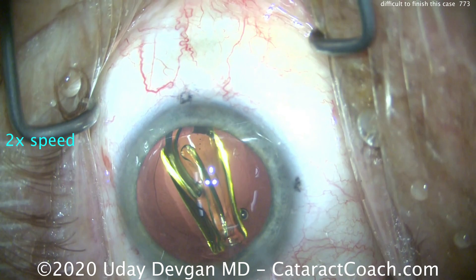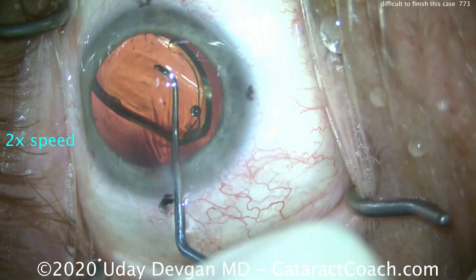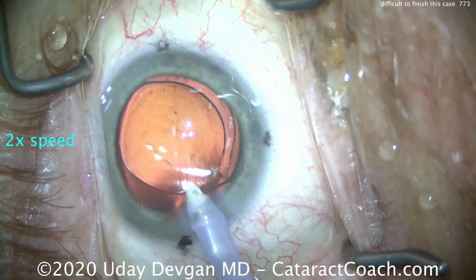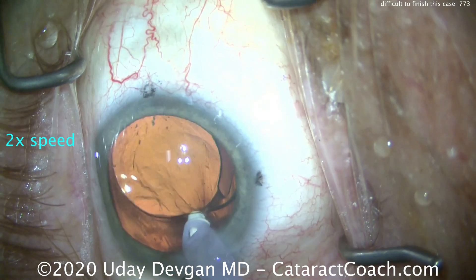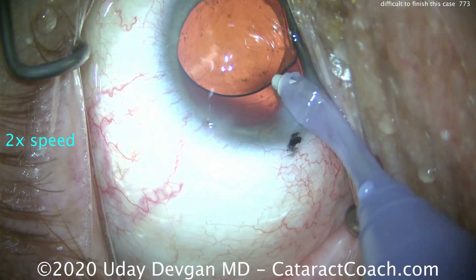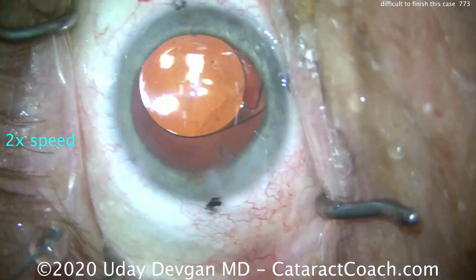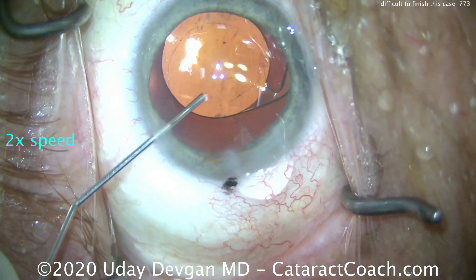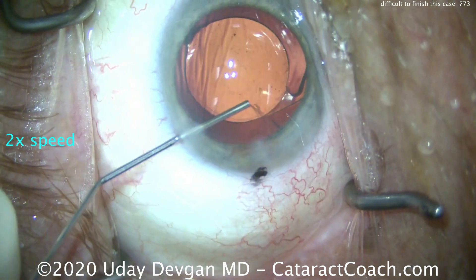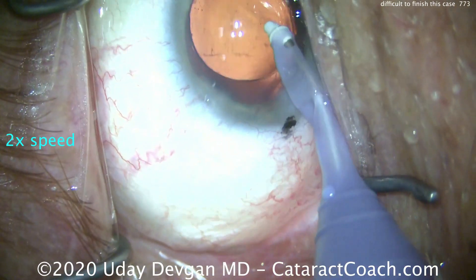So here comes the IOL. Again, the bag is shallow, so it's very difficult to get this thing dialed in where we want it. We finally get it into position. Now we can go in and remove the rest of that cortex and the viscoelastic from behind the IOL. We still have to do our normal techniques of removing viscoelastic from behind the IOL because there's a toric lens — we don't want it to rotate. We still have that persistent sub-incisional cortex, so I try to get it out manually using a 27-gauge cannula on a 3cc syringe. That helps to loosen it up.